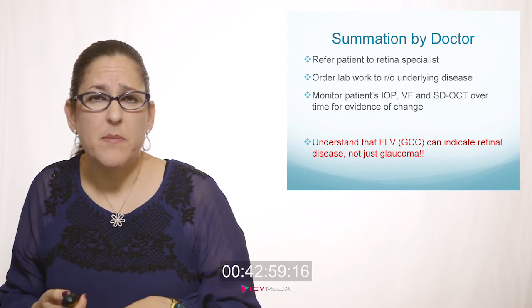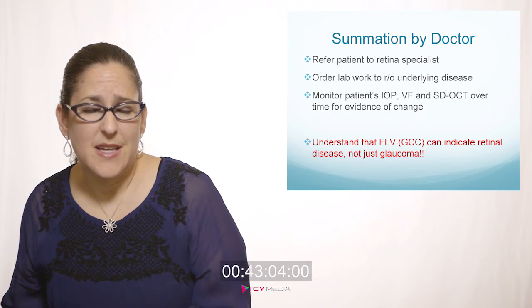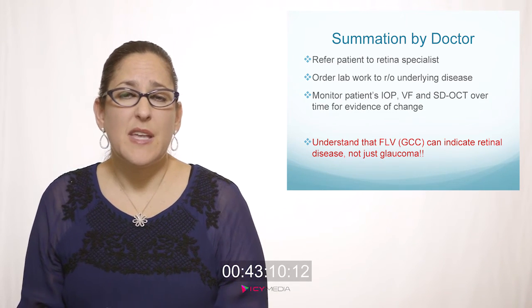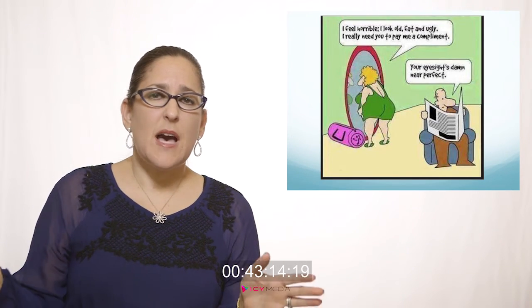I still see her all the time. We don't know why she has exudates, but we do know that that's what was affecting her OCT. So the take-home message on this case is that the FLV can indicate something more significant like a retinal problem than just glaucoma.